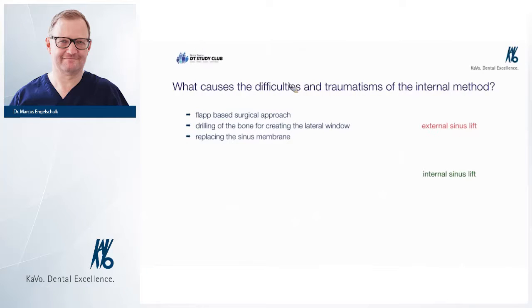And well, if you look at significant elevation, you see the balloon lift and the osteotome technique give too little height. And this is a problem because we can just use the internal way or the minimal invasive way for lifting, then it's again no problem, but the indication for this technique will shrink in your office.